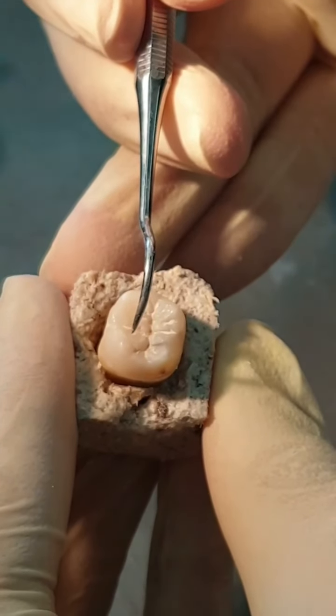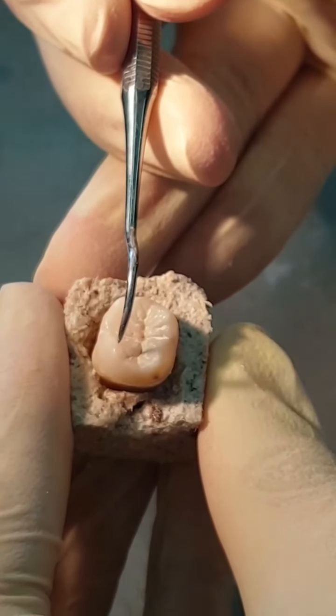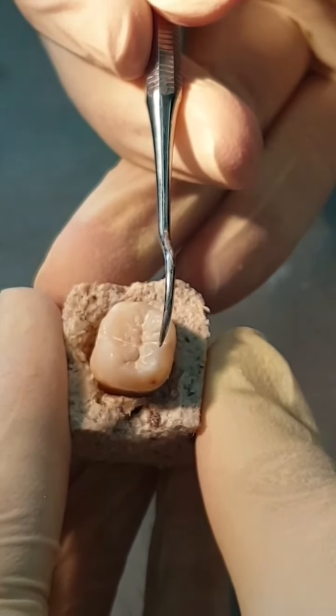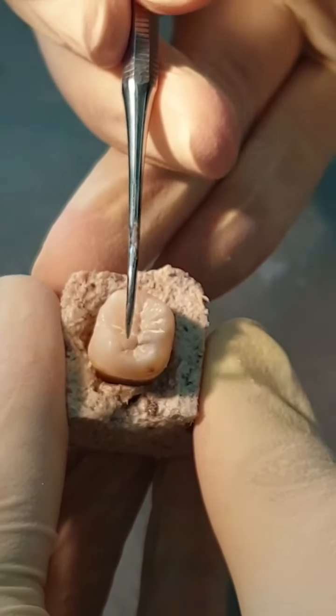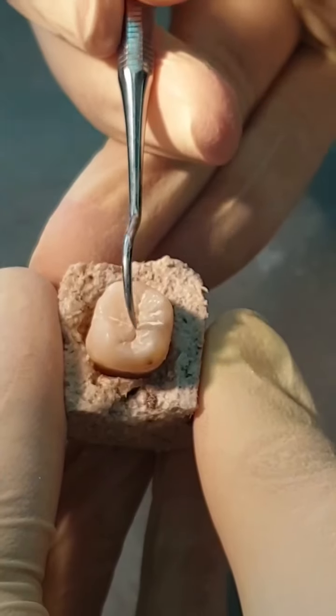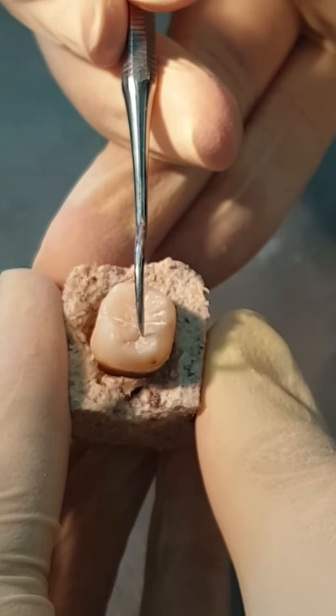In mesial root, we usually have two canals, mesiobuccal and mesiolingual. The mesiobuccal canal is located just under the mesiobuccal cusp tip, but the mesiolingual is near central groove, as I'm showing you now. So we don't need a lot of extension to mesiolingual.